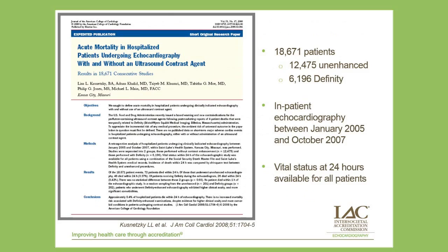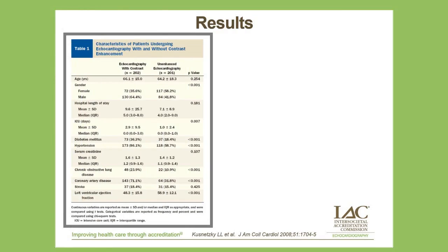Well, a number of investigator-initiated studies were published in the immediate aftermath of these warnings. This is one of the first of those, a retrospective study looking at acute mortality in hospitalized patients undergoing echo either with or without an ultrasound contrast agent. And as you can see here, of these 18,700 patients, about two-thirds underwent unenhanced echocardiography, one-third with the contrast agent Definity, and vital status was available for all of these patients at 24 hours after contrast agent administration.